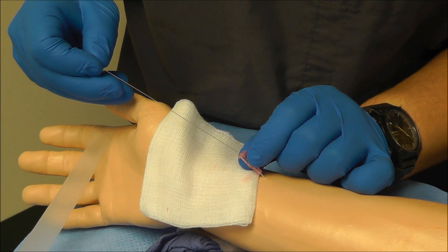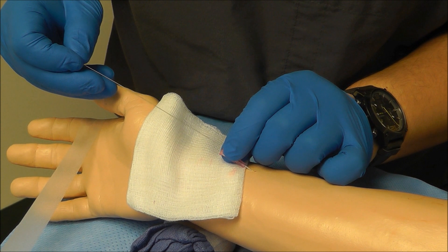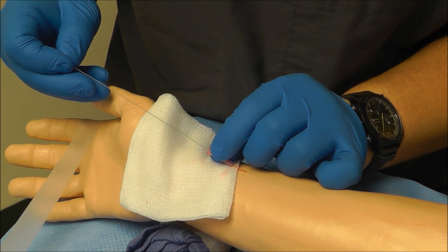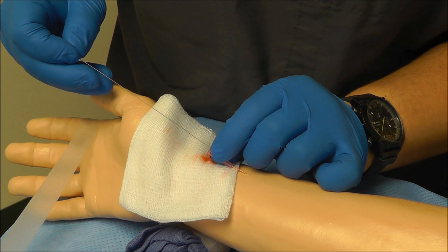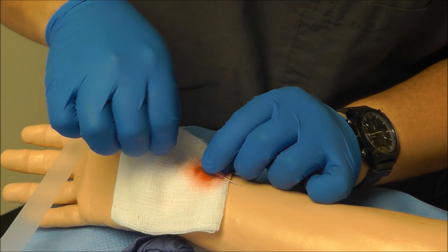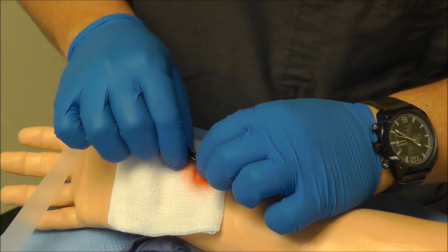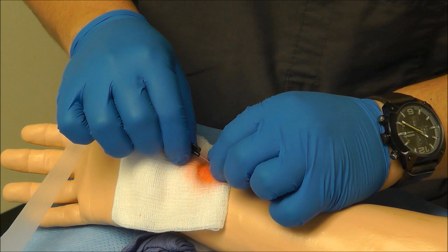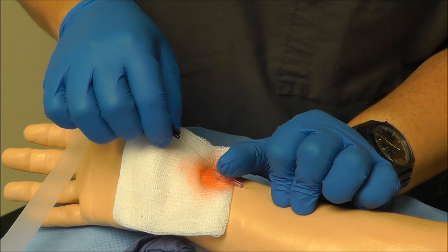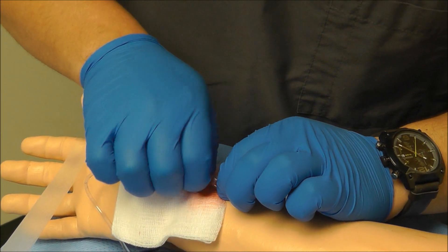Using the wire, go ahead and pull back on the catheter until you see blood flow. Now that I'm in the lumen of the artery, I can advance the wire in. Now that the wire is in the artery, I can advance the catheter over the wire, apply pressure, and pull out the wire. Then hook up with my transducer tubing.